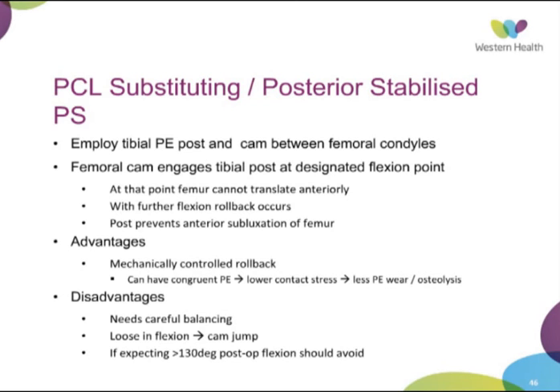And if you have, especially in the sagittal plane, a knee which is loose in flexion, you can have what's known as a cam jump, where the femoral component actually goes over the top of that tibial post, which can be very difficult to reduce without an anaesthetic. In patients that you're expecting a high flexion on, it's probably best to avoid these.